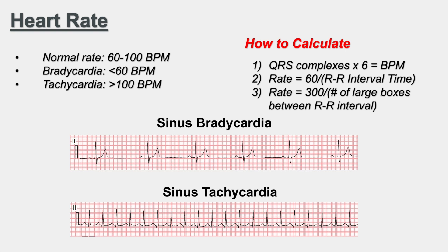Applying the same method to the sinus tachycardia strip, we count twenty QRS complexes. Twenty times six is 120 beats per minute — that is tachycardia.